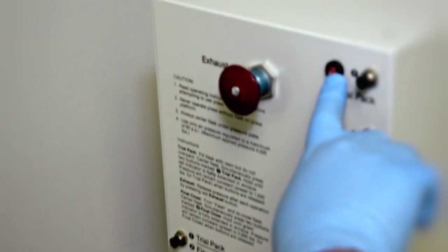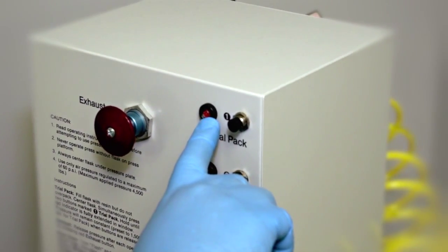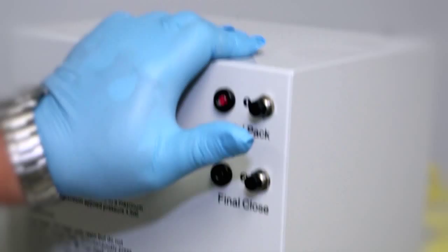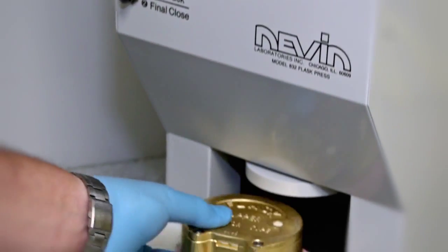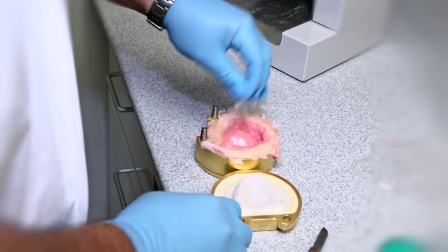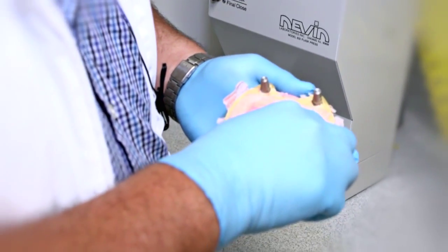This red indicator light shows. That means we're at the optimal pressure. We're going to hold it there for about a minute. Release the plunger. Pull the flask out. We have 2 sheets. Very easy to come out. The sheets come off. This is the first trial pack.